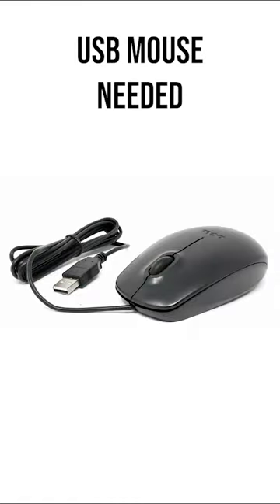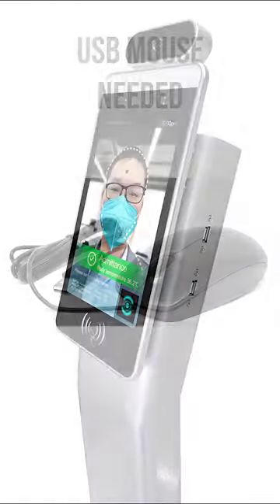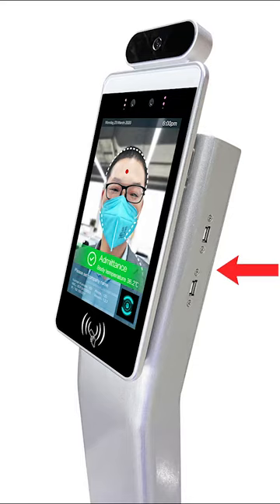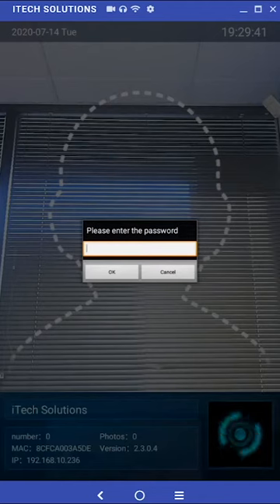To get started you will need a USB mouse. After powering on the device you will need to connect your USB mouse to either of the two USB connectors on the back of the device. Click the middle mouse button to bring up the application menu.